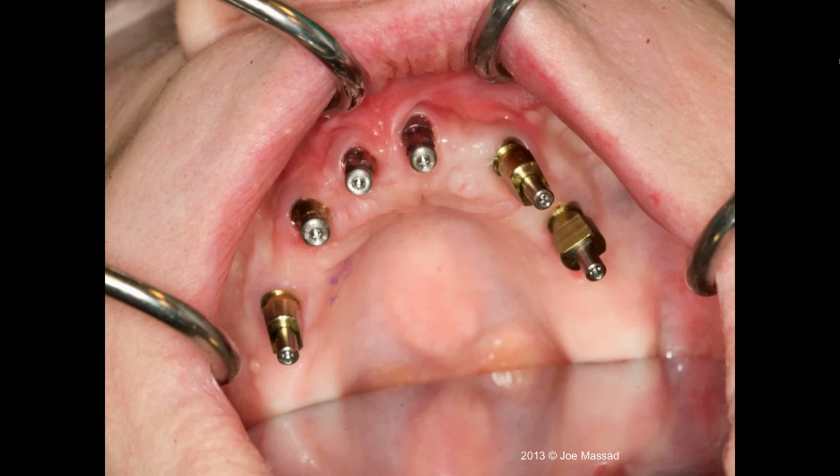And the rationale for doing a combination open and closed method in this particular case would be that we didn't have to cut as many holes into the tray, because many times when you perforate the tray multiple times or use a complete open tray, where is it going to get its support or stiffness? So there's issues if they're not exactly perfectly in the center of the tray.